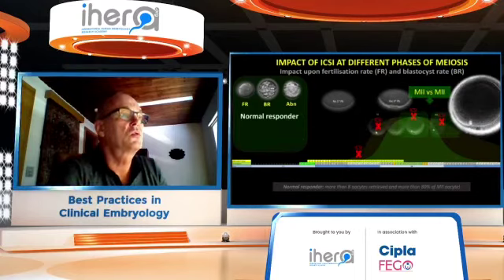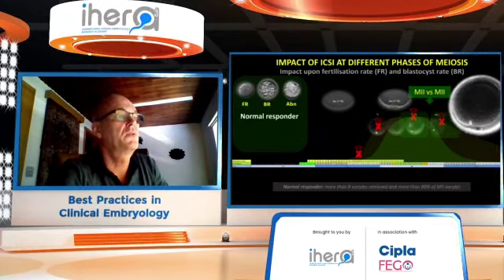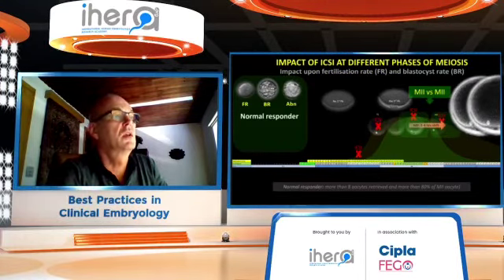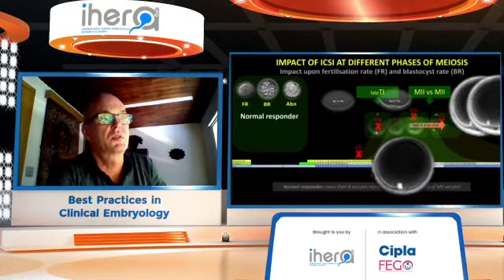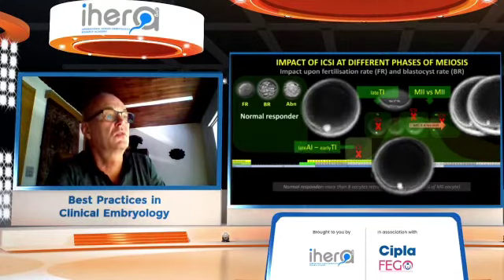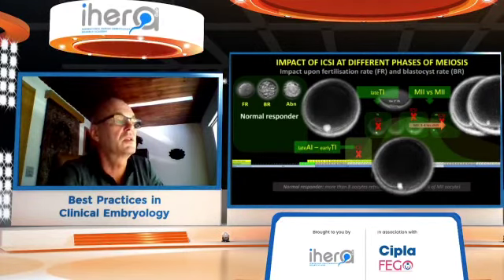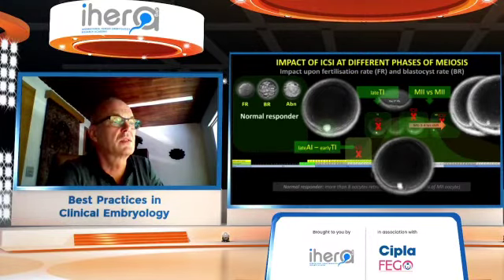In metaphase 2 oocytes, we also wanted to find out if an ICSI shift of 3-4 hours can influence the results. For the second group, we used telophase 1 oocytes with an extruded first polar body, and for the third group, we used the oocytes at anaphase or early telophase, meaning those with visible signs of cytokinesis.